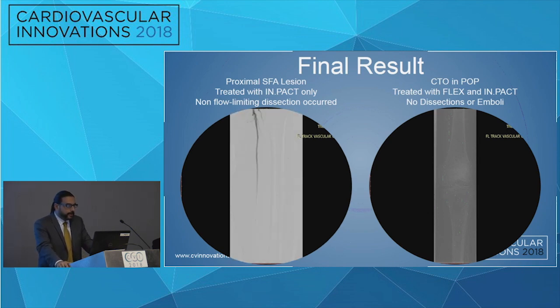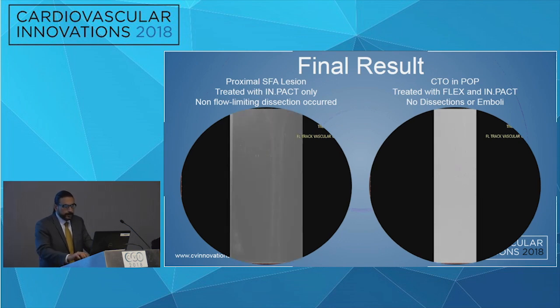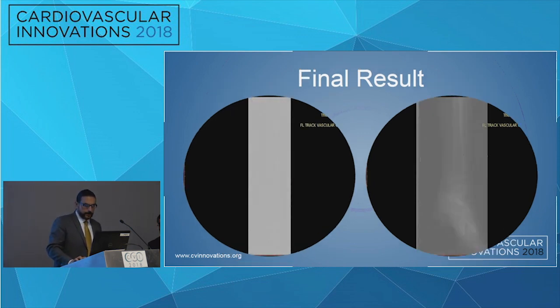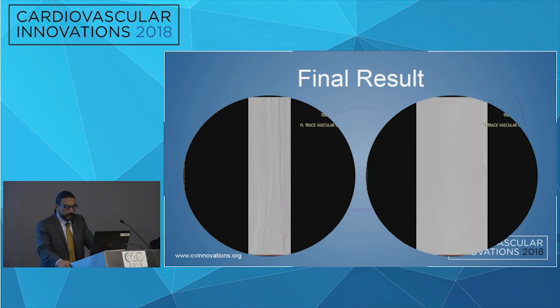The proximal SFA lesion, as you see, was treated with IMPACT only. Okay, I do see a small little dissection, but it's non-flow limiting. And then the distal lesion in the pop with the P1, P2 segment there, you can see that no dissections or emboli, and you see nice filling of the infragenicular trifurcation. And then clearly you want to make sure that the tibials down the foot look okay, and you can take my word for it, but they do. And the peroneal also fills, and then you can see the plantar arches again fill quite nicely and complete the arch in totality.